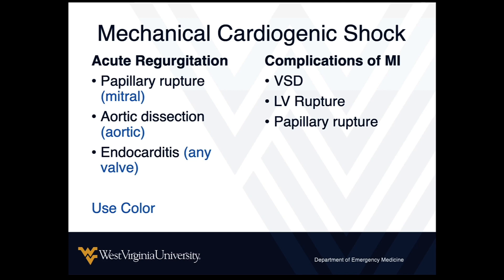We'll look at using color. If you have a little bit of suspicion, throw color across the valve. If you're earlier in your stage of learning ultrasound, after you feel pretty good about getting your normal views, start practicing putting color on the mitral and aortic valve and get your eyes accustomed to what the normal color pattern looks like throughout the cardiac cycle. MI complications are typically accompanied by regional wall motion abnormalities.